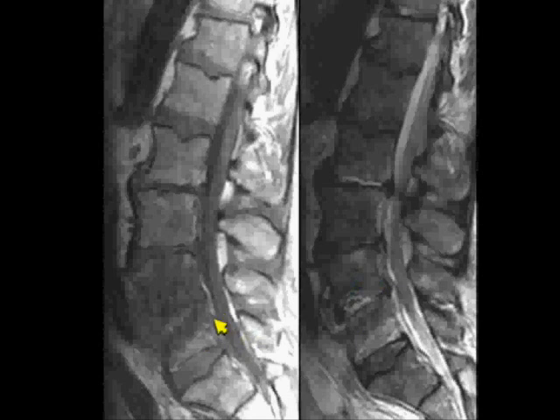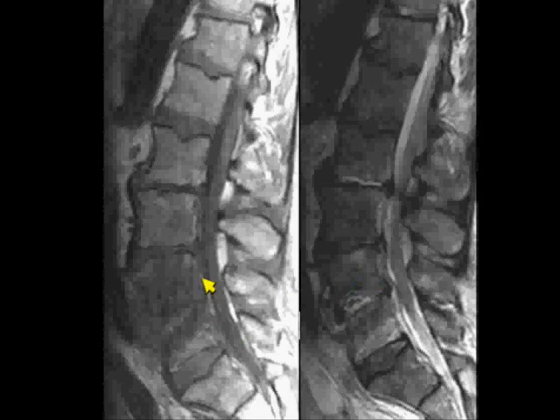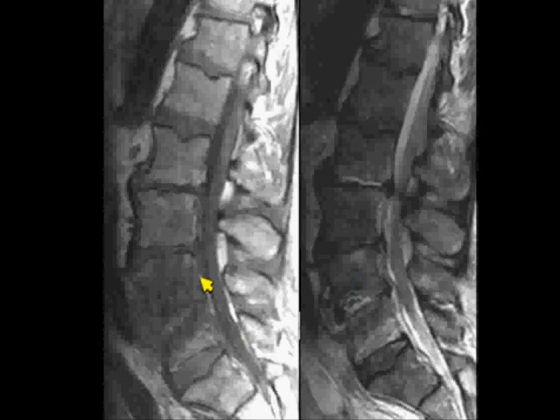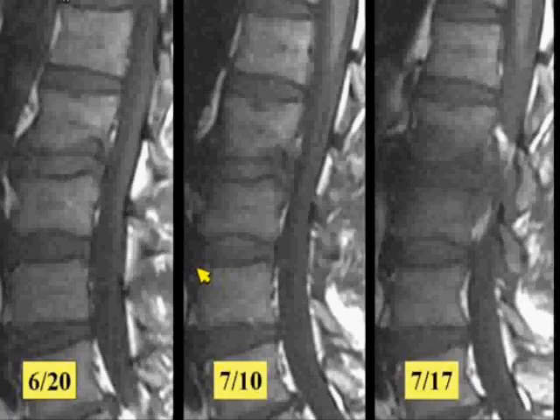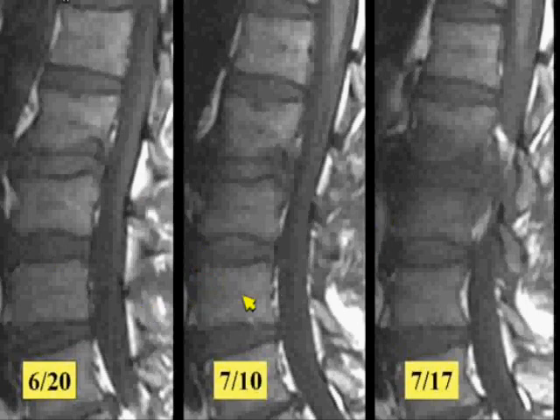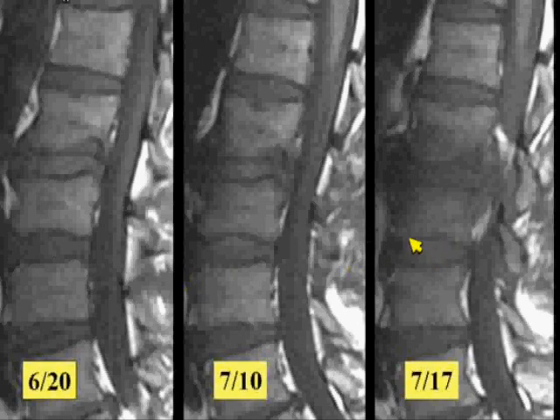In the sense of test-taking, you will never be presented with this. But in reality, it's much uglier when you're trying to look at these cases. There is an overlap — early, early disc space infection versus bad degenerative disease, you just can't tell. It doesn't matter what sequence you throw at it, you're not going to be able to tell the difference. This is as good as I've seen for missing the study as it progresses into a disc space infection.